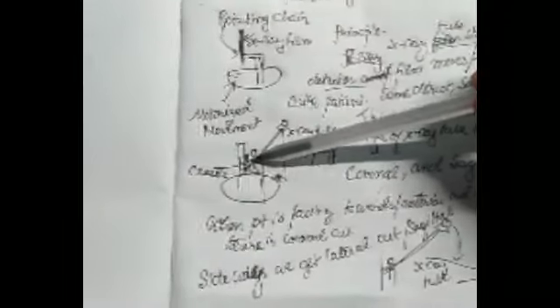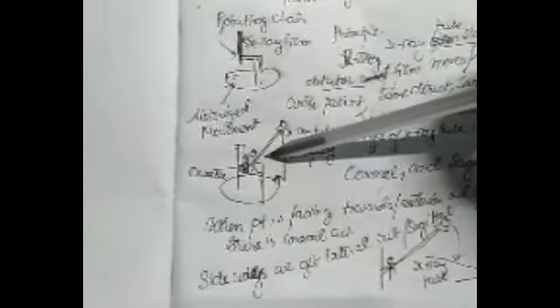Here the X-ray tube is always kept in an oblique direction. So this is the patient and this is the cassette. Only the patient and the cassette will move. And what images do we acquire? We acquire the images in coronal and sagittal section. If you want to make a coronal image, you have to place the cassette behind, that is posteriorly, or place the cassette anteriorly, and then once the tube is rotating, it is going to acquire the image.